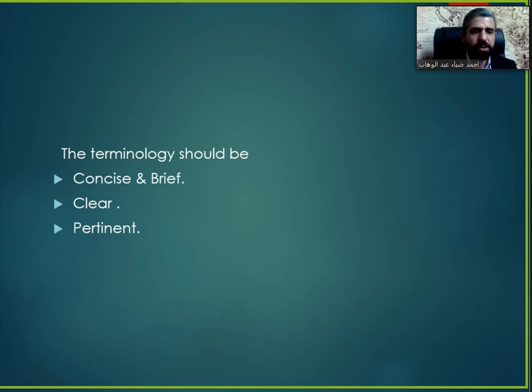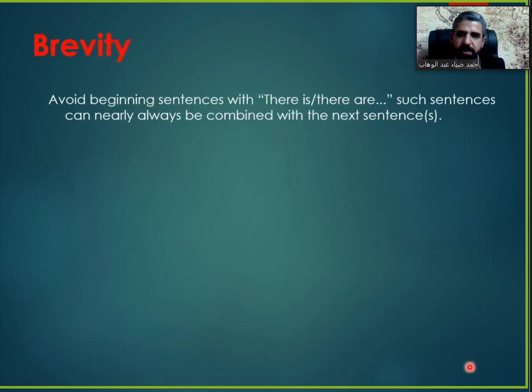Now, this is the most interesting thing of this talk. The terminology that we use in the radiology report should be concise and brief, and should be clear and should be pertinent. We will discuss every one of that in the following slides. First, what do we mean by brevity?